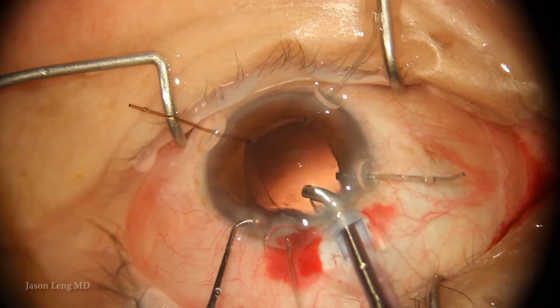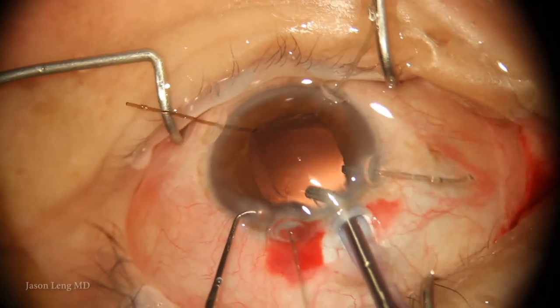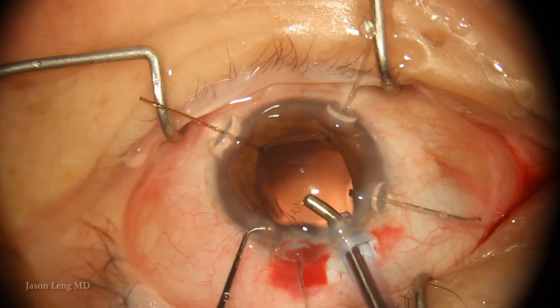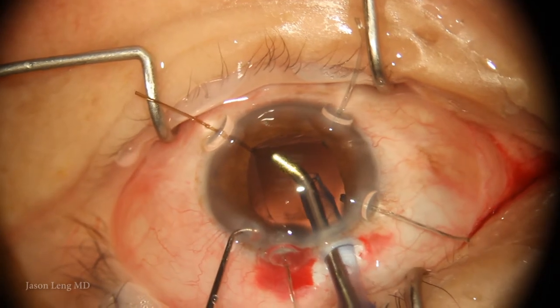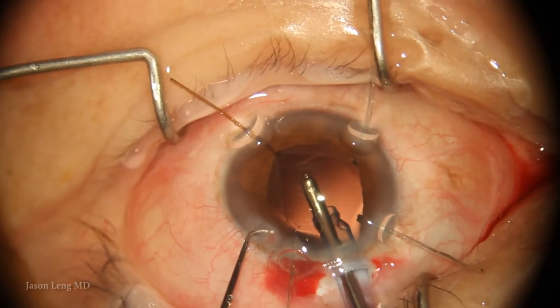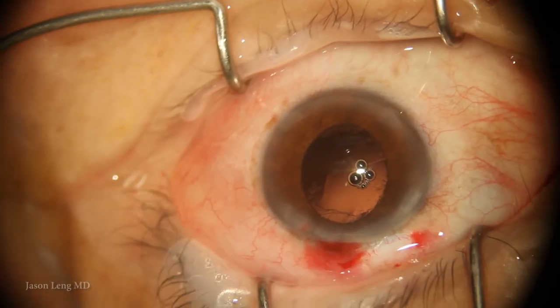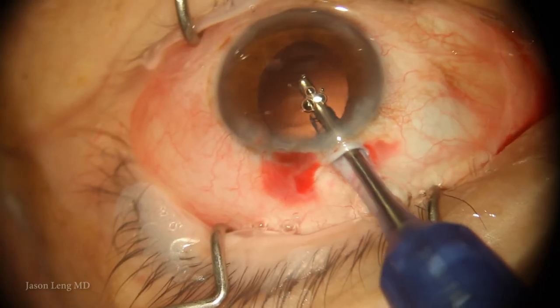At this point I'm deciding whether to put a capsular tension ring — but I really didn't think that would hold, as there weren't enough zonules to support it. I was also thinking about putting in a Cionni ring, but with that much zonule loss, I didn't think even a one-point fixation of the bag would be adequate.